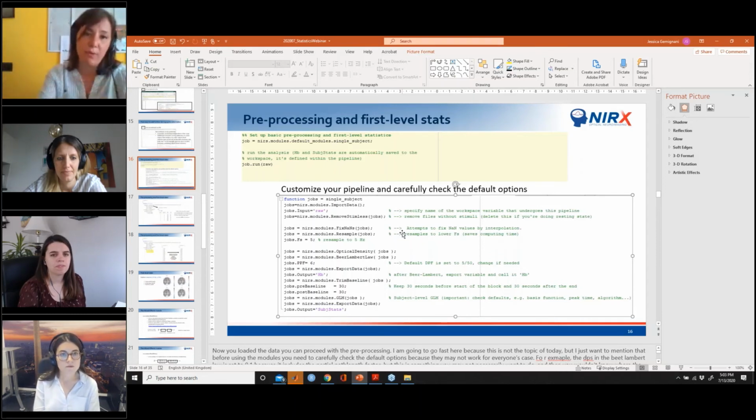This you need to report, because this is what gives you main effect of group, main effect of condition, interaction effect. And then you need to go further and follow up on those effects that resulted significant from this first step. In that sense, yes, you need to report first the ANOVA and then the post-hoc tests.